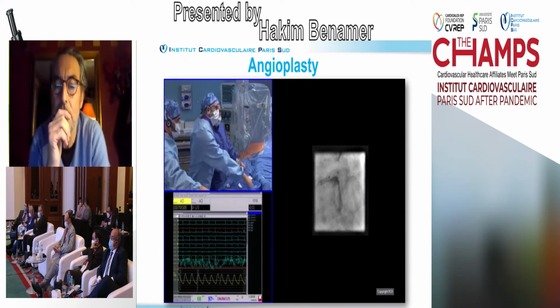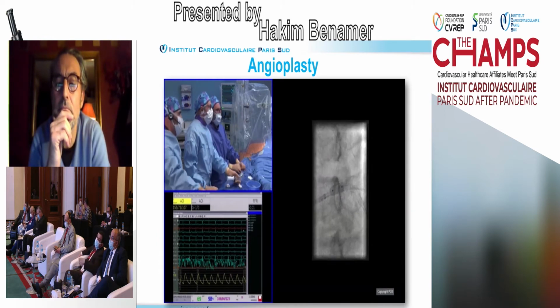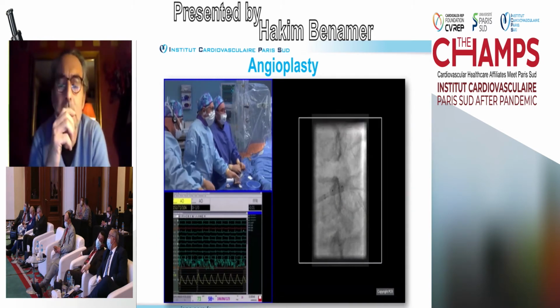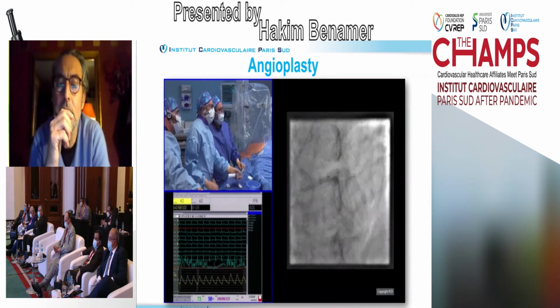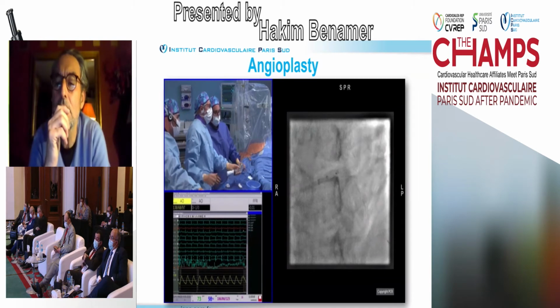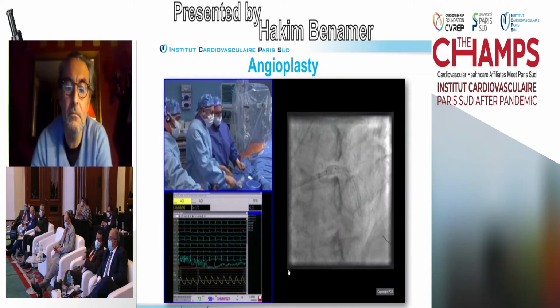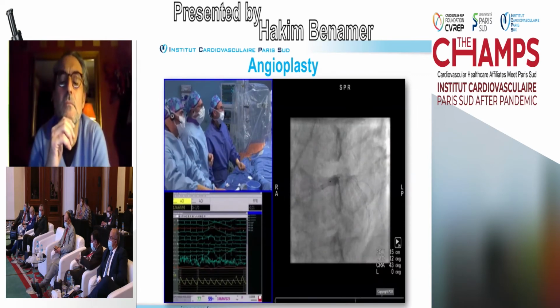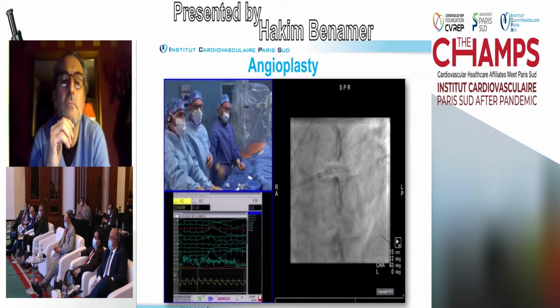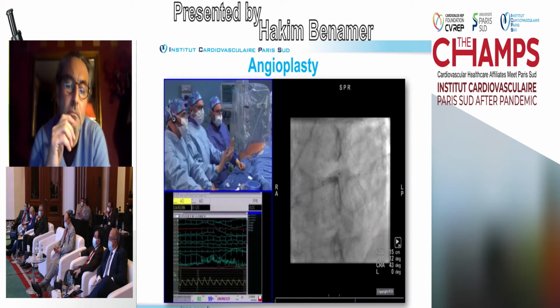Second aspect is that they could also identify areas that would be adequate for landing the stents. For example, in this distal part that you can see here, there is much more circumferential plaque than the place that they have chosen for landing. I'm just taking this as an example. They are also making the measurements for the subsequent treatment of the vessel. And finally, one of the most relevant aspects any time that you treat a left main is understanding the mismatch in vessel diameter between the left main and the landing zone. It's going to be very important.